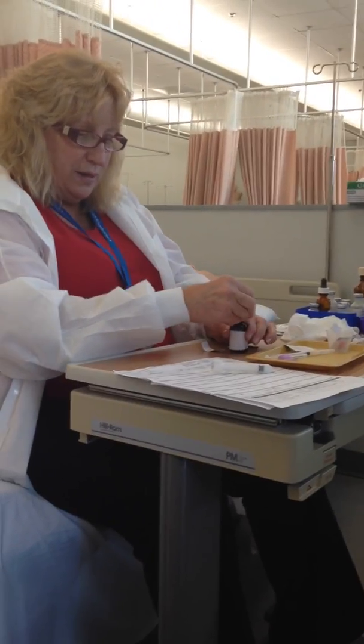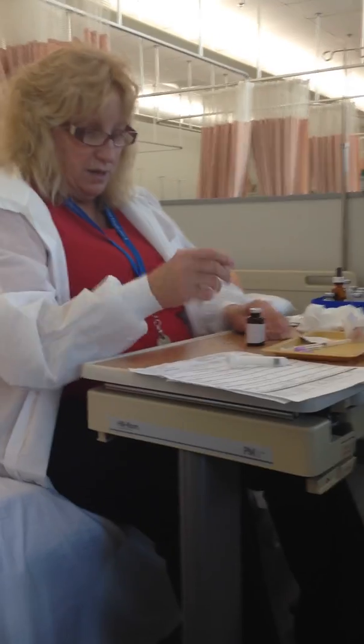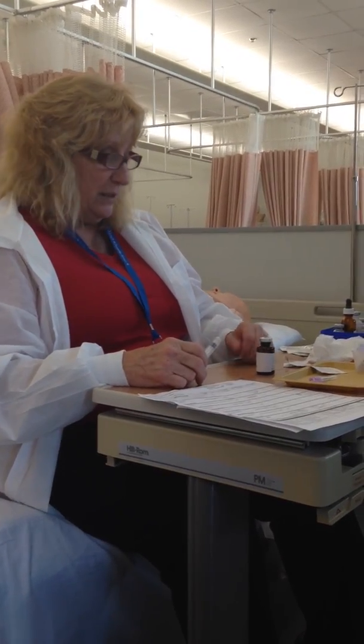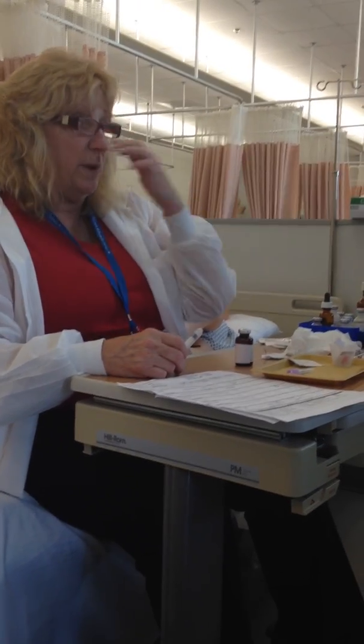Okay, so we're going to get ready to draw this. And that's the next part of how I watch you do that. We do this without gloves because we're in the med room. And this is the part you have to do sterilely. You're not going to be playing with syringes that are already open on this test. And Monday, I'll be here from 9 to 12 to help anybody out.